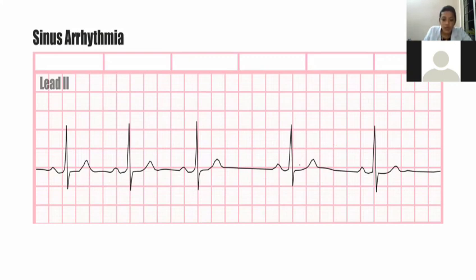So in this way, you have to assess the P wave, Q wave, and the frequency of each wave, and the distance between them or the time taken for the other waves to come, so that by seeing it you can say that the ECG is following a regular or an irregular rhythm. So this is about sinus dysrhythmias. It consists of sinus bradycardia, tachycardia, and sinus arrhythmia.